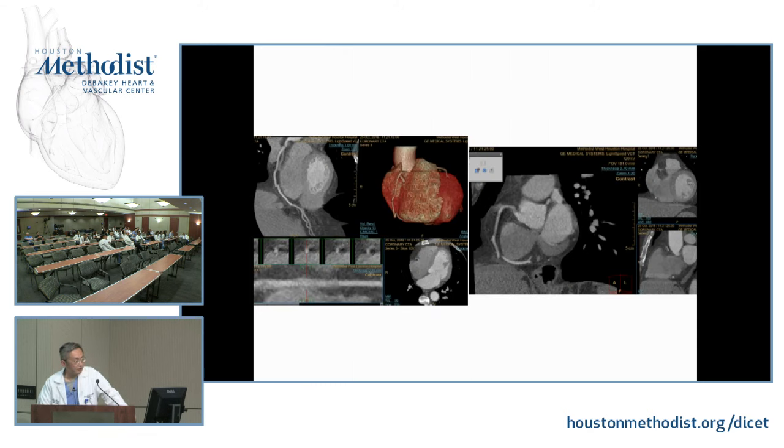So last, I want to show you two cases, okay? They're both patients in their 50s. One done with our scanner in West Houston with the GE. One done here with our dual source scanner. Both had an equivocal stress test. Okay, so what do you see here, Dr. Yang? What do you think about image quality?